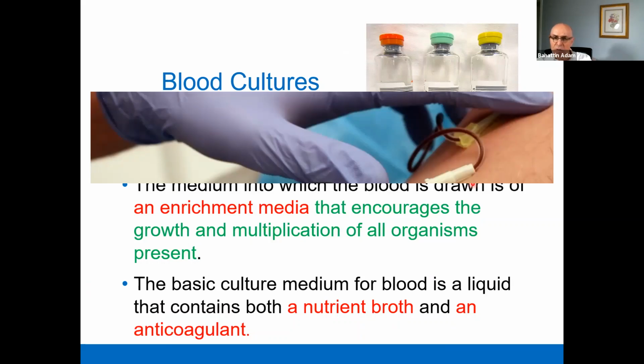The content of these media may differ from each other in order to let the microorganisms grow enough.